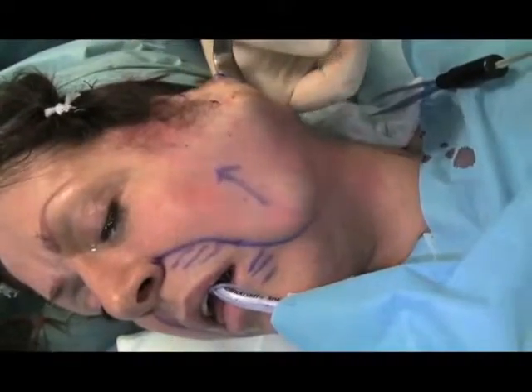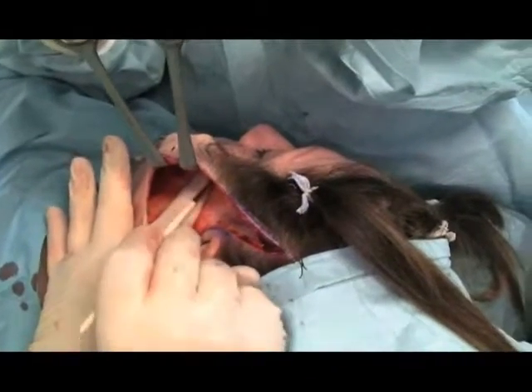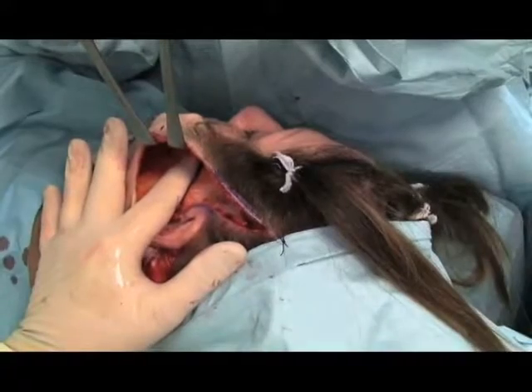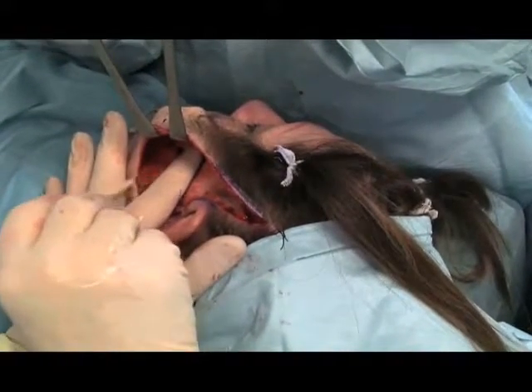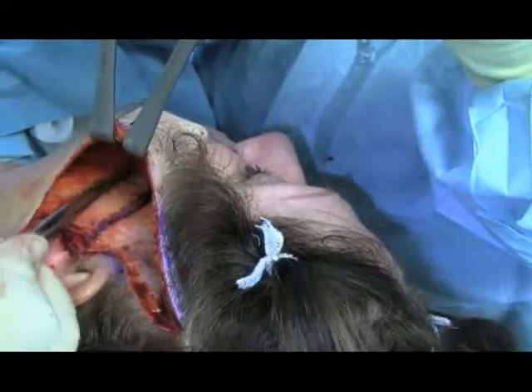The extent of subcutaneous dissection is shown here. For placement of the key-plication sutures, a finger is placed on the inferior border of the zygomatic arch and two parallel lines drawn. This has been found to assist with symmetrical placement of sutures on both sides.